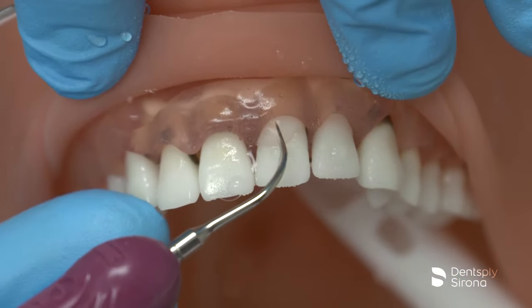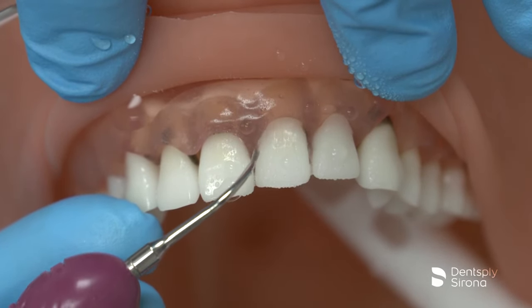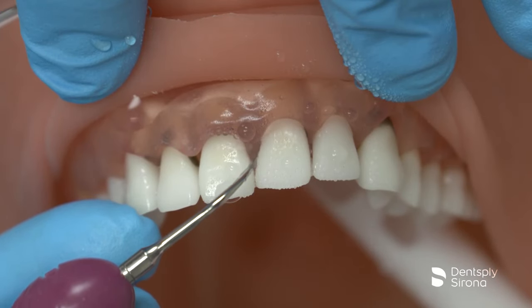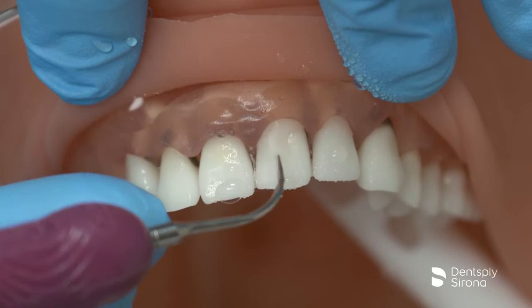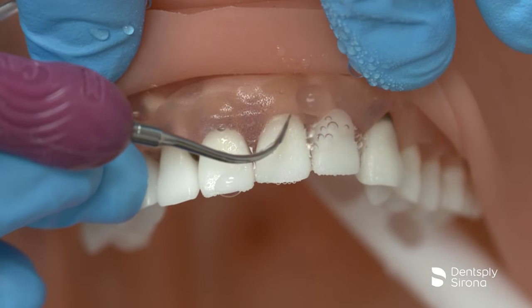Due to the ultra-thin diameter of this insert, it is imperative to maintain 2-3 mm adaptation of the lateral and/or back surfaces of the insert at all times. Once the clinician has approached the line angle, the clinician will adapt more obliquely to allow adaptation under the contact.